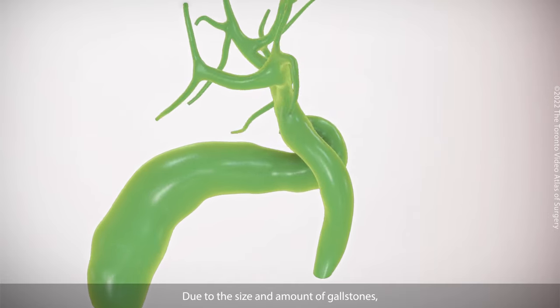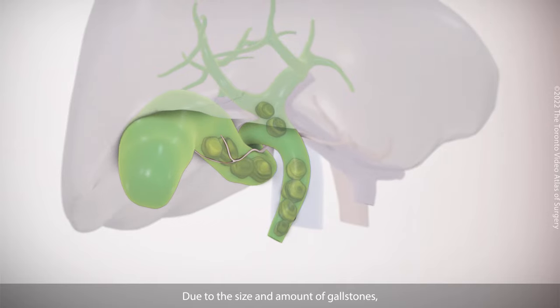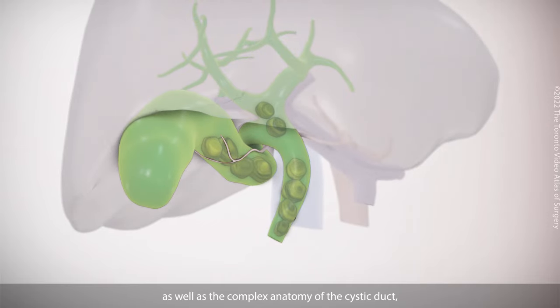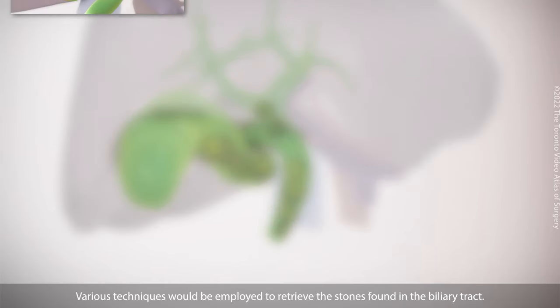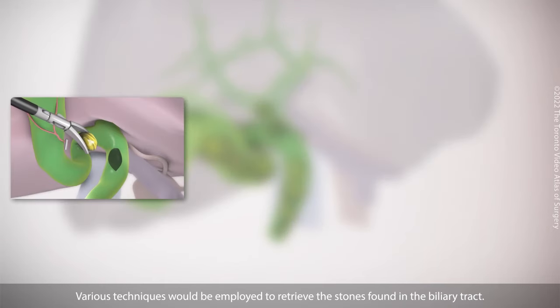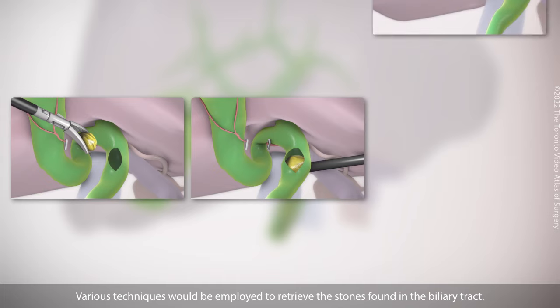Due to the size and amount of gallstones, as well as the complex anatomy of the cystic duct, a trans-choledocal approach was elected for common bile duct exploration. Various techniques would be employed to retrieve the stones found in the biliary tract.